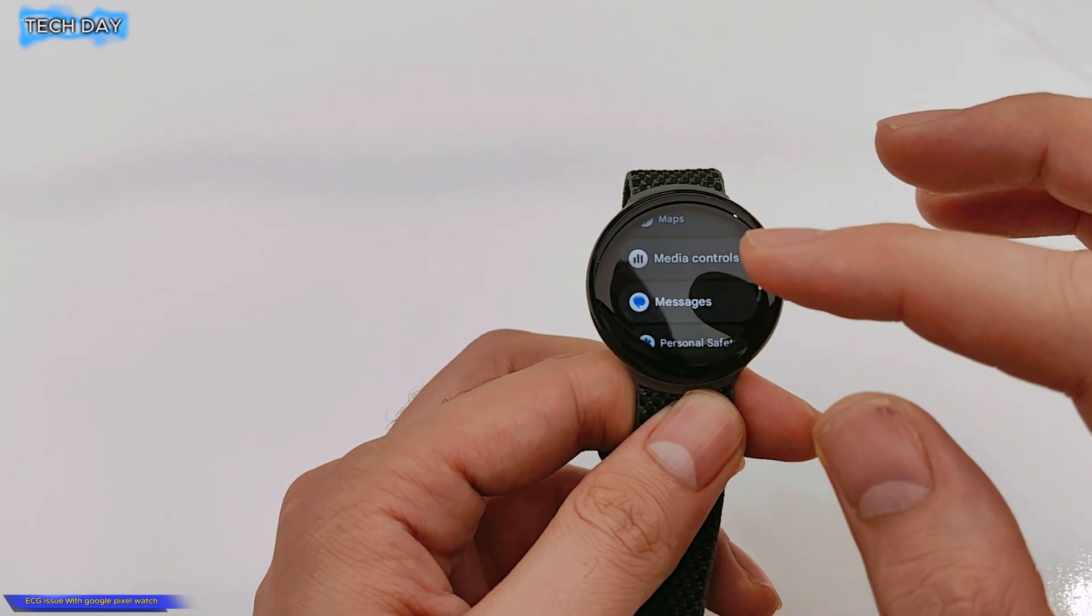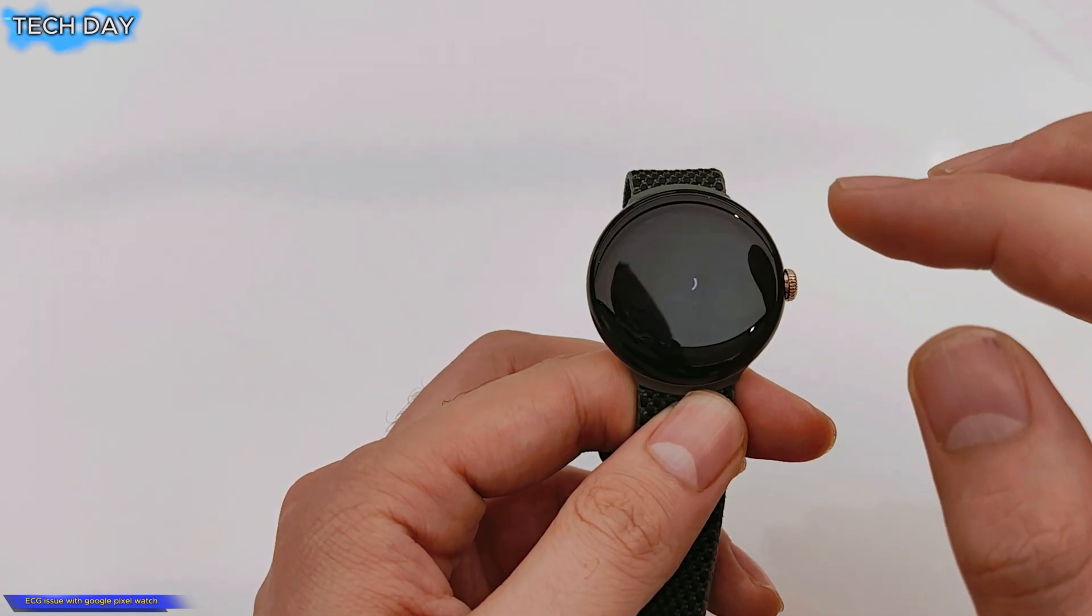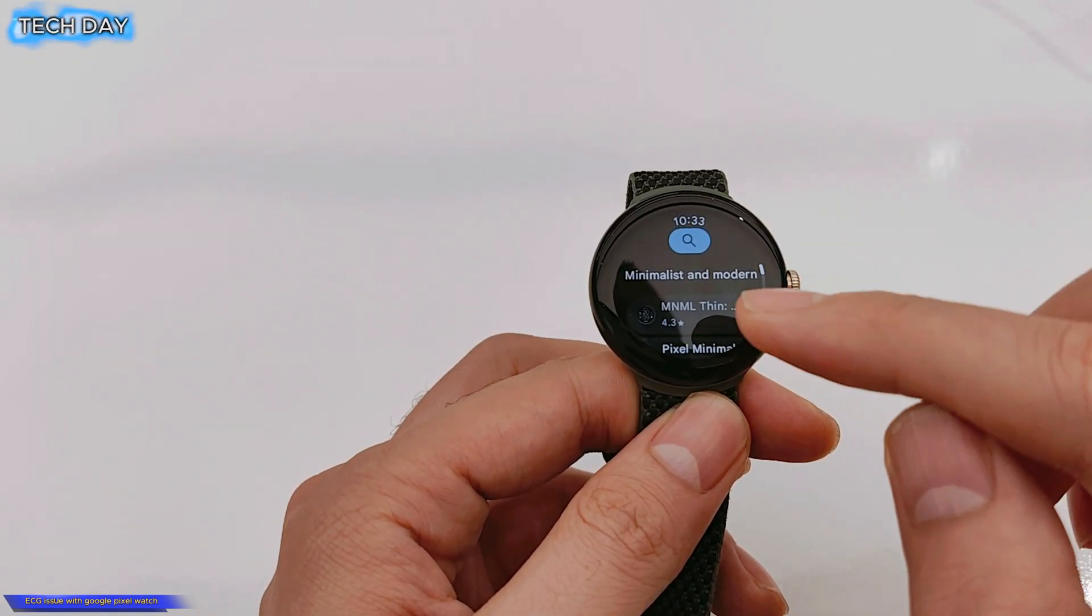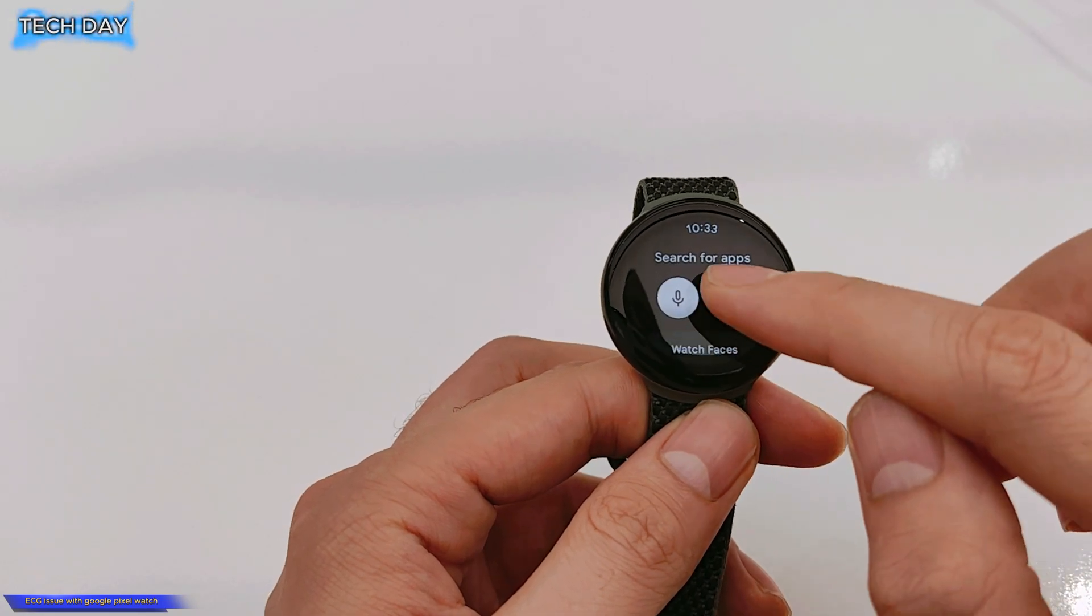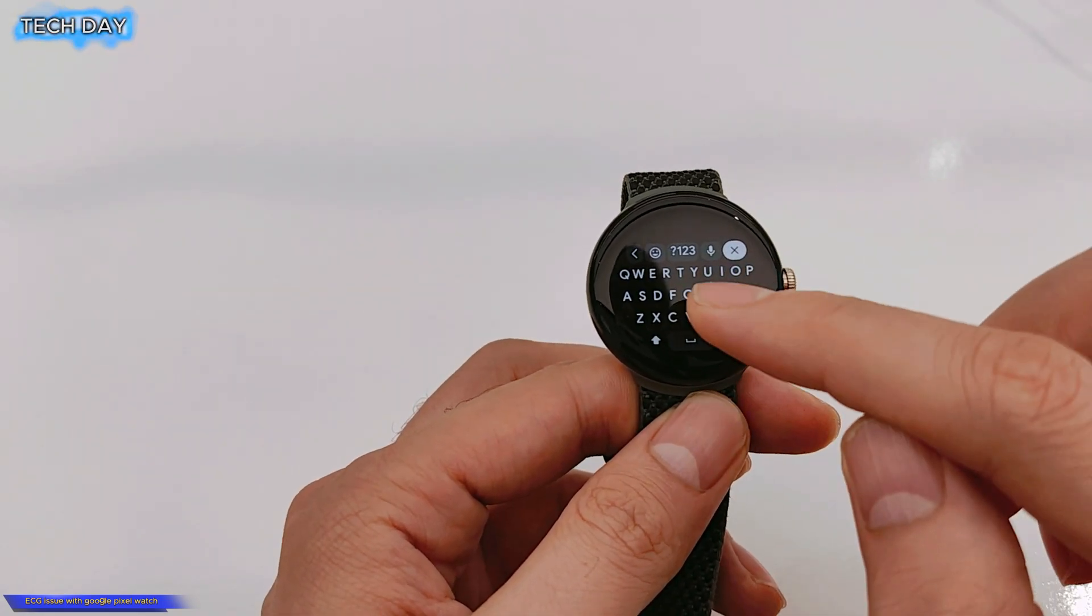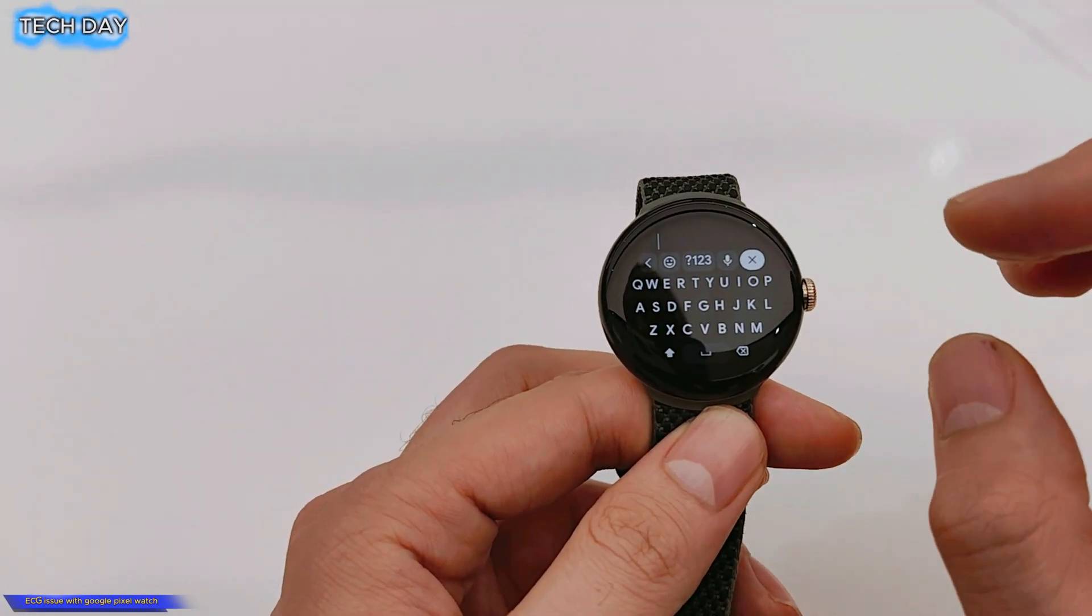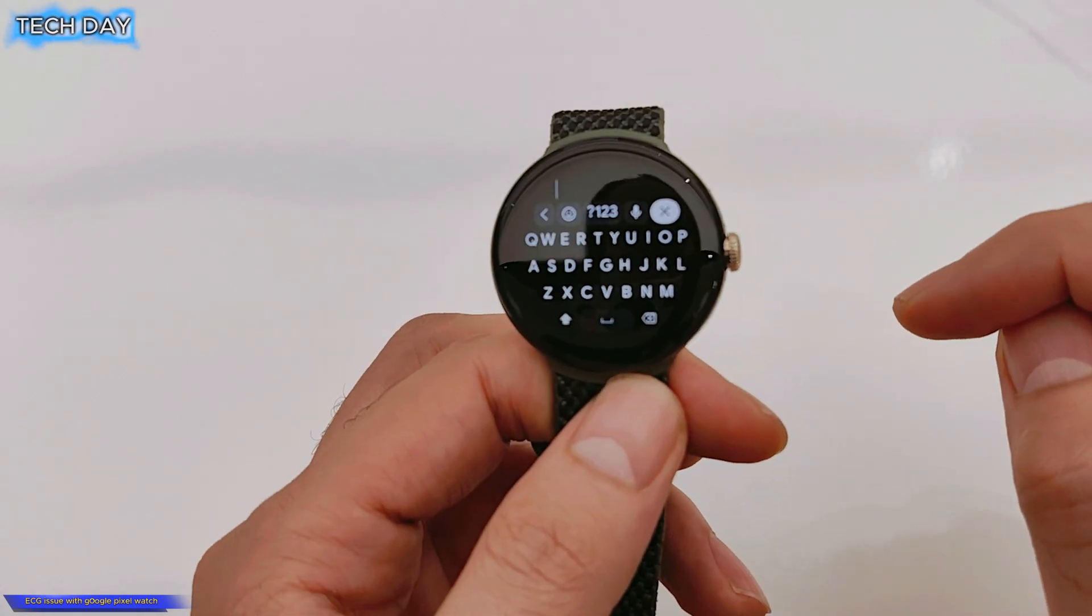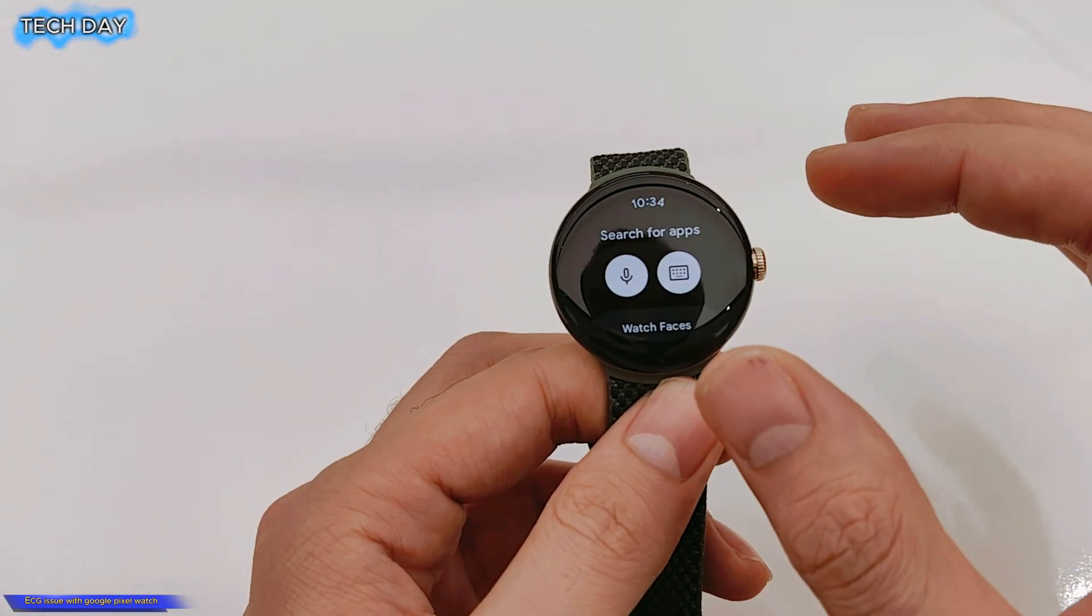In this video I will show you exactly how to get the Fitbit ECG if you cannot find it in your Google Pixel watch. So the first thing you need to do is to go to the Play Store.